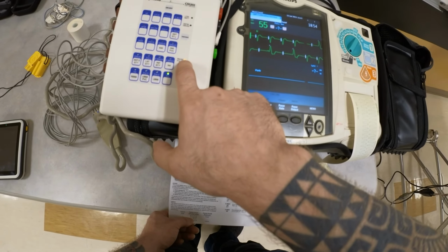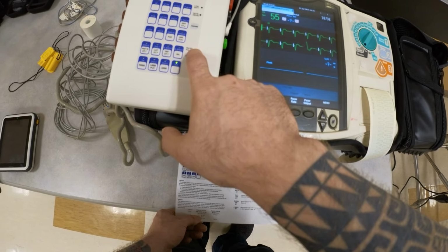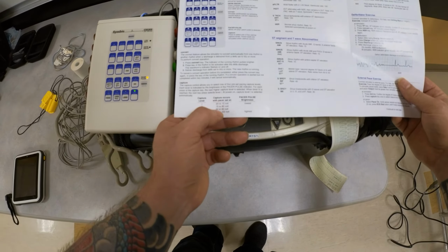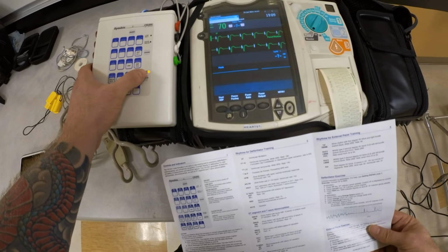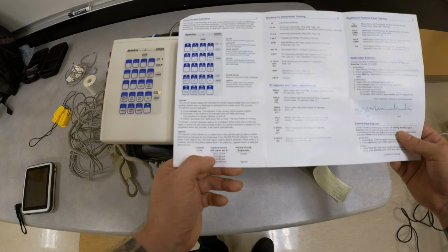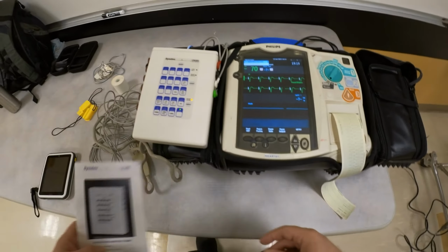And now you notice the pacer impulse is blinking to indicate that it is in fact functional and able to pace. So here, level 1, 2, 3, and 4 with different settings, and how you cycle through them. You basically just press capture, and it will go to the next mode. If you turn off the unit, it will cycle back to the default mode, which will be level 1. Right? So this is how you would employ this device with all these features.